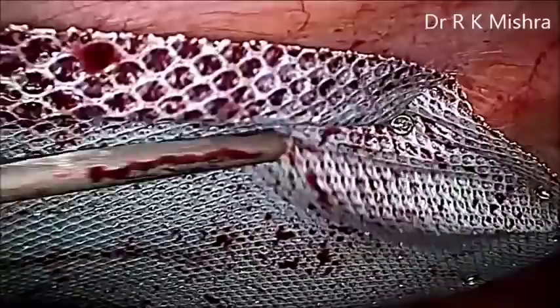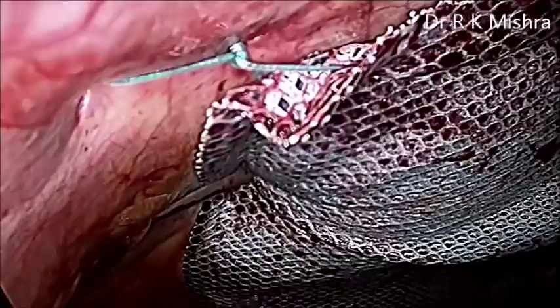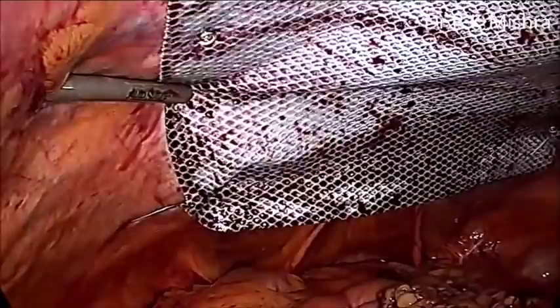The purpose of this is to stabilize the mesh until fibrosis happens and the mesh will be covered by the peritoneum again. It should be opposed by the left hand from above so that while firing, the abdominal wall comes perpendicular to the tip of the ProTack so that it can go deeper. Although it doesn't come up to the skin, care should be taken not to fire the ProTack at the level where the defect is. It should be fired all around, taking care of the inferior epigastric vessel, because if you fire over it, bleeding can start.